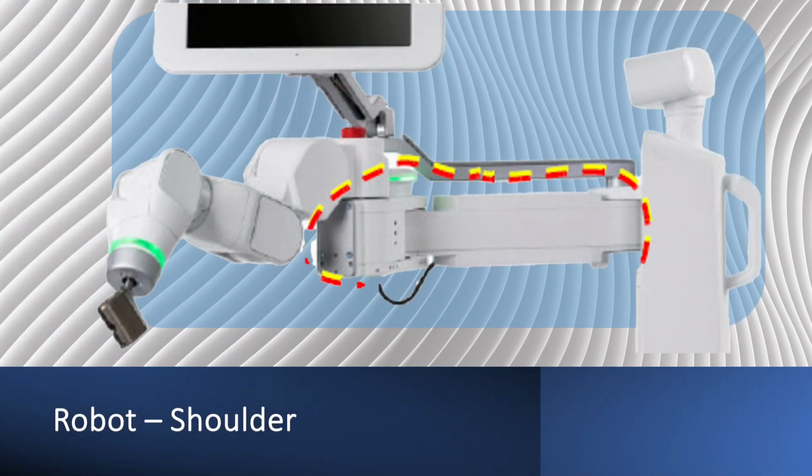The shoulder is the adjustable component of the surgical system, enabling the surgical arm to move along the horizontal plane parallel to the operating table. The shoulder button is used to toggle and control shoulder adjustments.